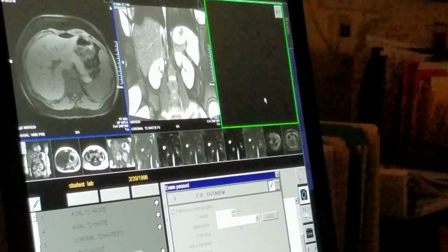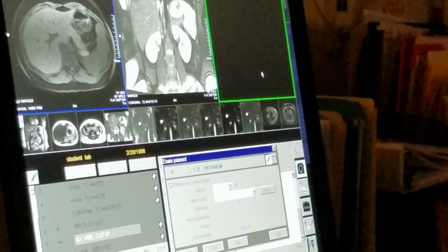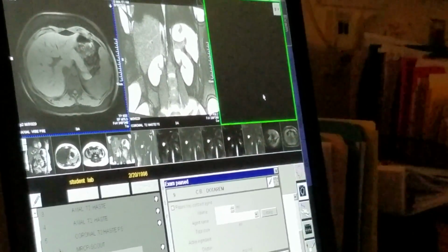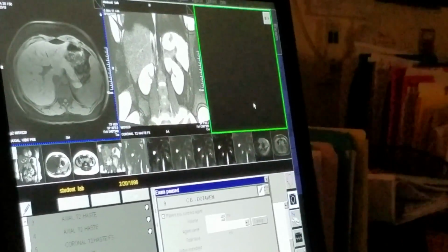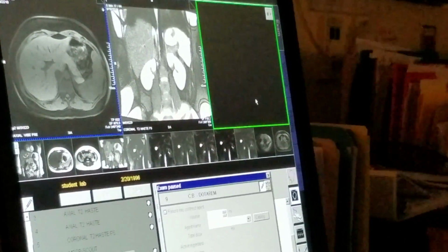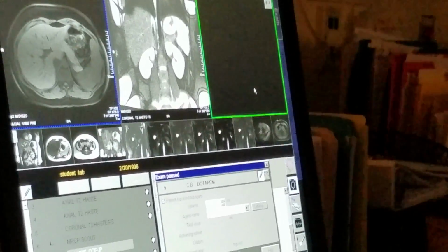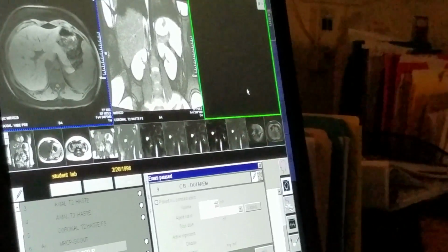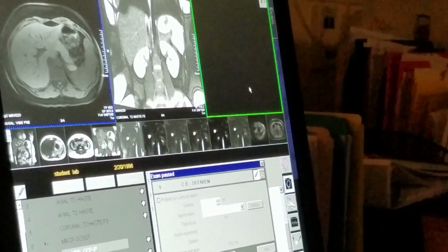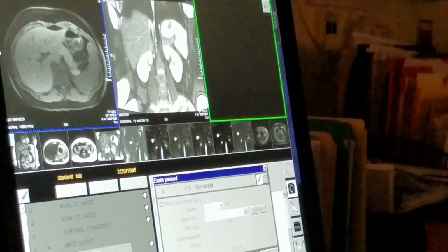You'll see it come through the anterior part of the heart, which is the RV. Then you'll see it in the posterior part of the heart, which is the left atrium. After it leaves the left atrium, it's only got one place to go, and that's to the left ventricle, up and out the aorta. So once you see it in the posterior part of the heart, start to anticipate, okay, here comes the contrast. And when you see it come down the top part of the thoracic aorta, then you can start giving your breath hold instructions. So we'll hit continue here.